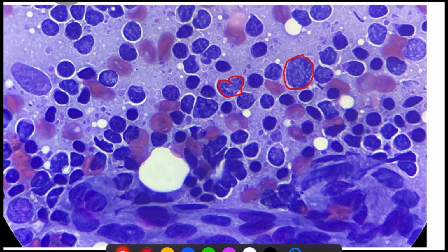Yes, it is difficult to differentiate B and T cells in lymph node cytology, but some of the books say that if the cell has a cytoplasmic process, it is mostly of T cell type, but we cannot judge in each and every case.